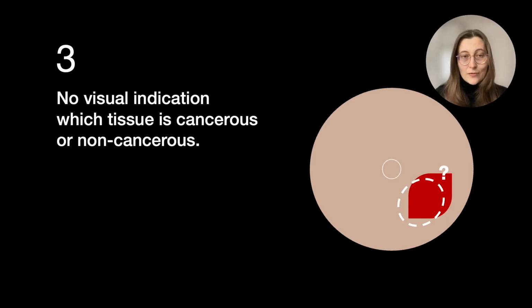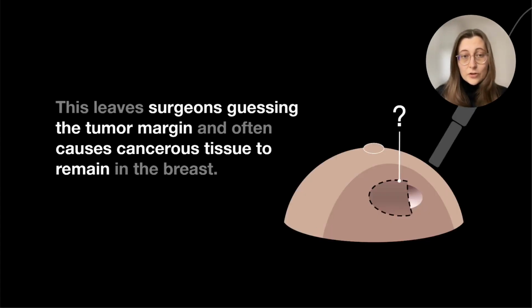And lastly, after surgeons have made an incision, there's no visual indication if a tissue is cancerous or not. These circumstances leave surgeons guessing the tumor margin and often cause cancerous tissue to remain in the breast, leading to about 15% of patients requiring reoperation.